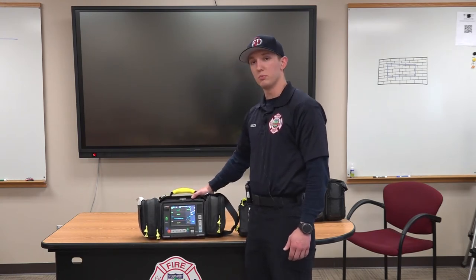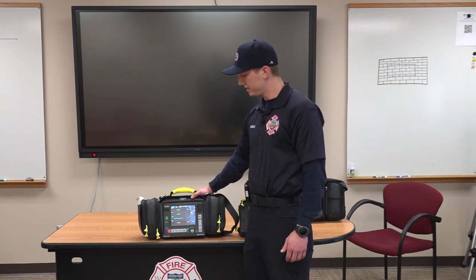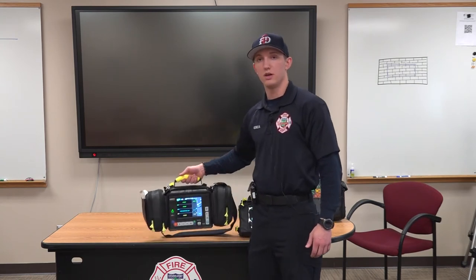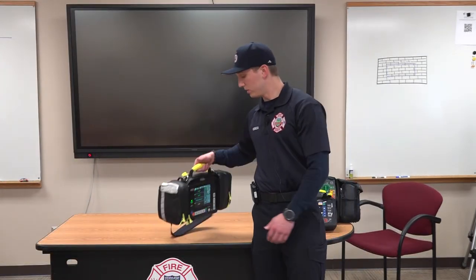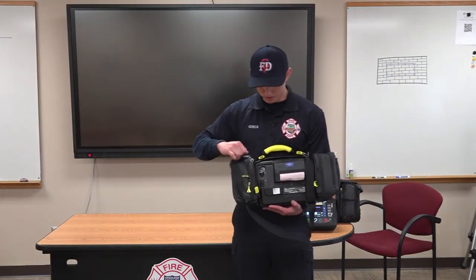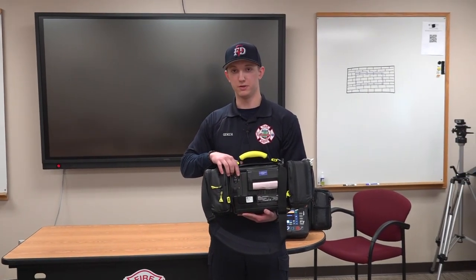These monitors are capable of taking blood pressure, SpO2, 12-lead, pacing, cardioversion, and defibrillation. Another ability it has is a 3.2 megapixel camera on the back, so we can take pictures of whatever we need.